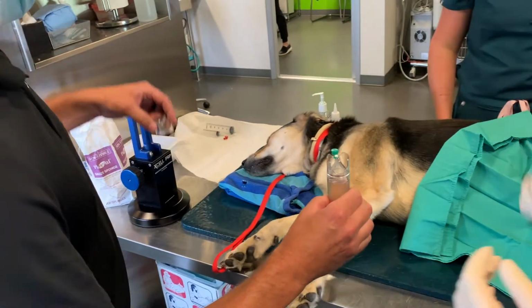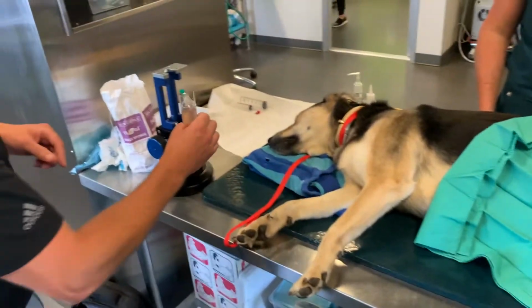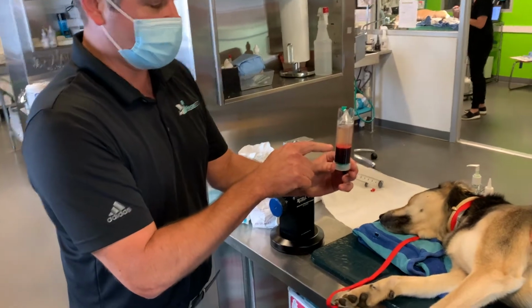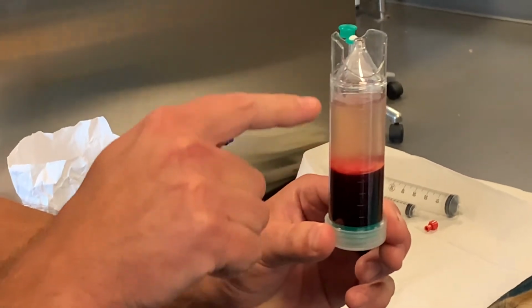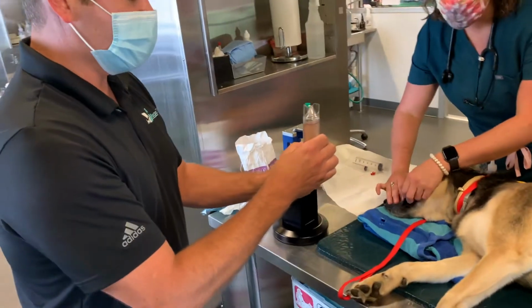And if you do get something on there, you could just dab it down with some alcohol. Yeah. So the next step. So here we've got your red blood cells, really nice looking buffy coat right there, and this is your plasma, and the platelet-rich plasma is right above the buffy coat, and the rest of this up top is platelet poor plasma. Okay. So we're going to use the concentration device.